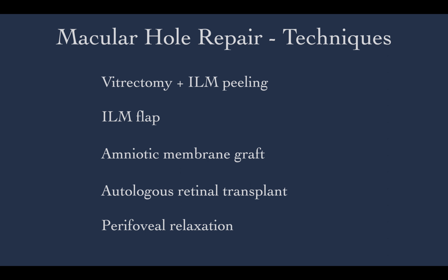The amniotic membrane may be placed on the epimacular fascia rather than subretinal placement, given that glial cells may migrate across the amniotic membrane scaffold in an epimacular fashion to achieve hole closure.